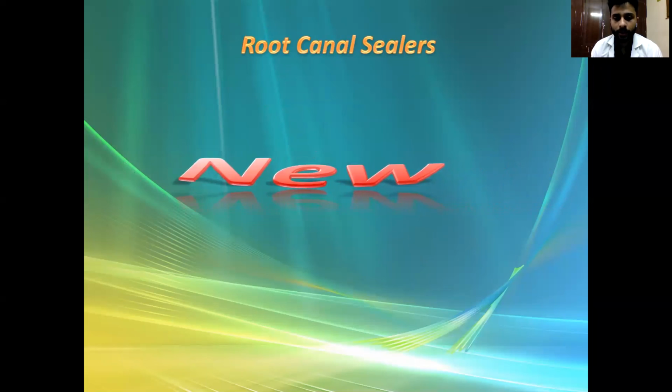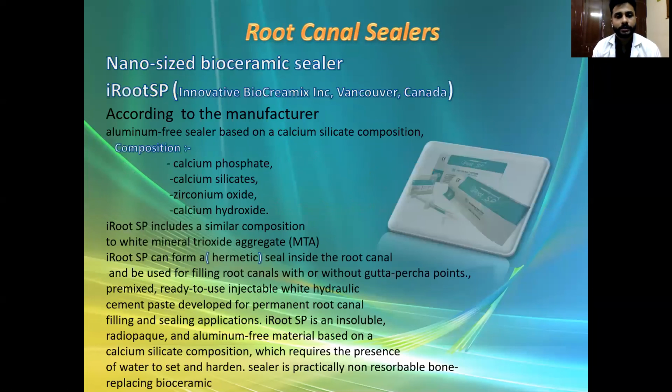So these are the new root canal sealers which were found recently. The nano-sized bioceramic sealer, iRoot SP. It has calcium phosphate, calcium silicate, zirconium oxide, and calcium hydroxide. iRoot SP includes a similar composition to white MTA, and it can form a hermetic seal inside the root canal and be used for filling of root canals with or without gutta-percha points.